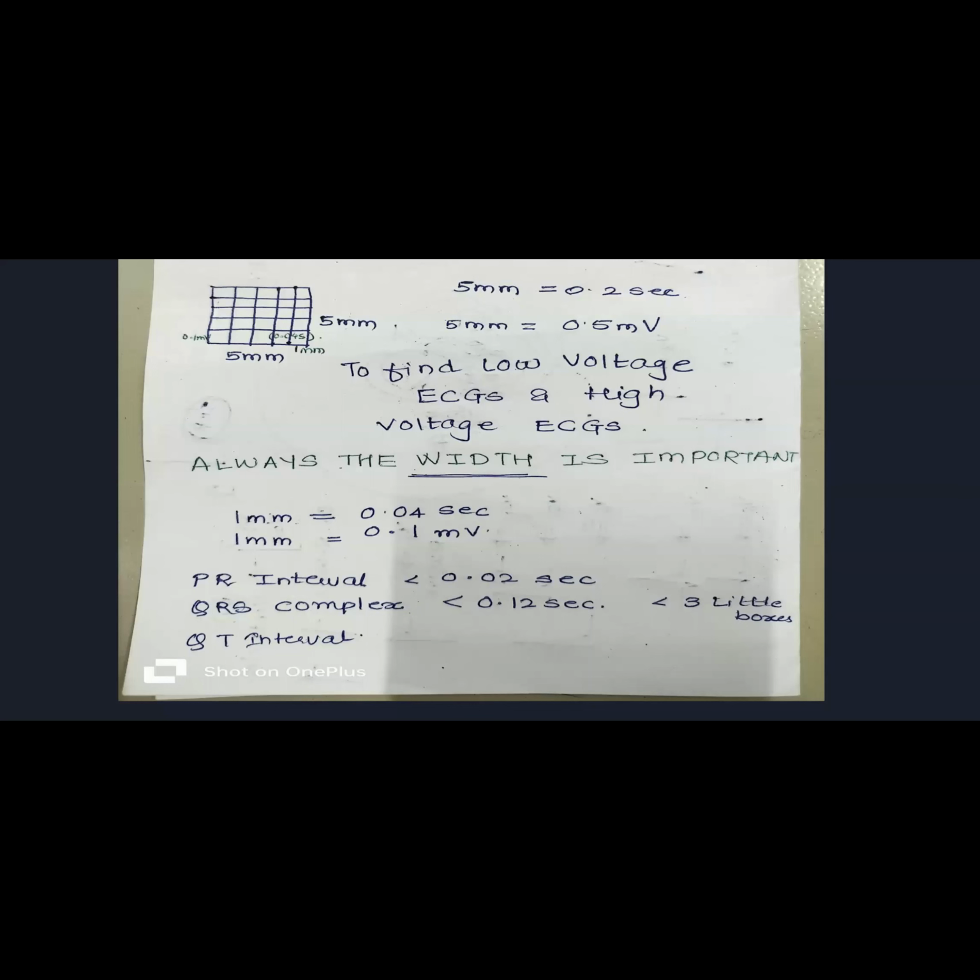Now, to calculate the heart rate, we always look at lead 2. Lead 2 is more specific to heart rate. The easiest trick is to take 300 as the numerator and divide it by the number of large boxes between two RR intervals. This can only be done if you have a sinus rhythm.